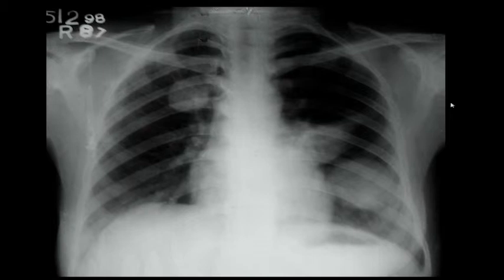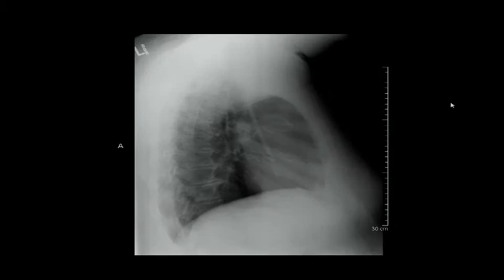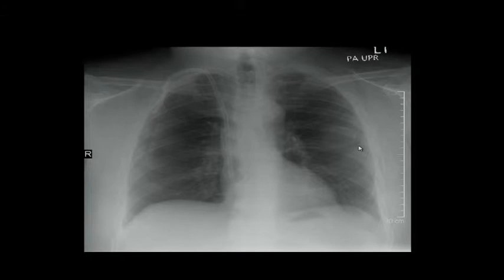So let's go back to that case. Why did you say that this was not in the lung, Sylvia? Because I see that it's, let's say, cortical, has cortex. The first button, the one that has a green ball on it. Okay. This is like cortical bone. So good. One, that you could see that it was continuing with the rib.